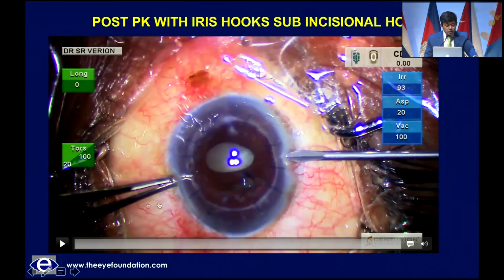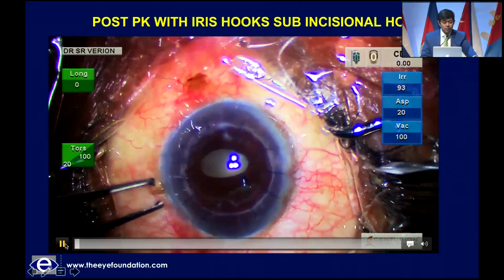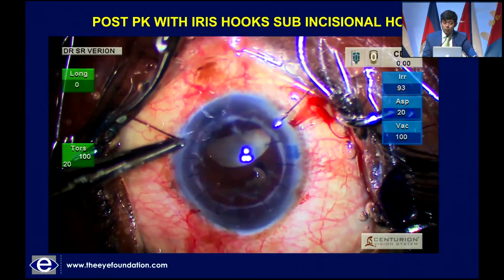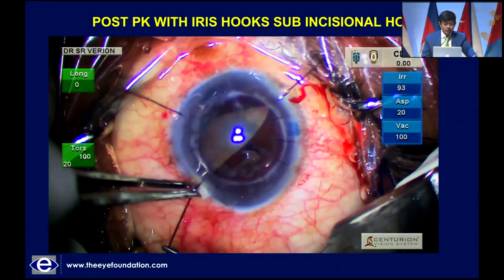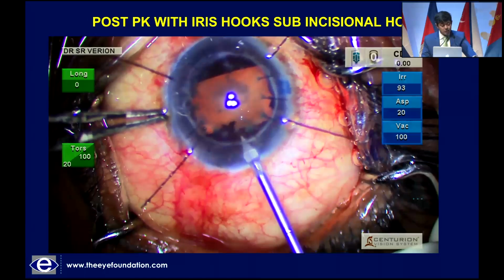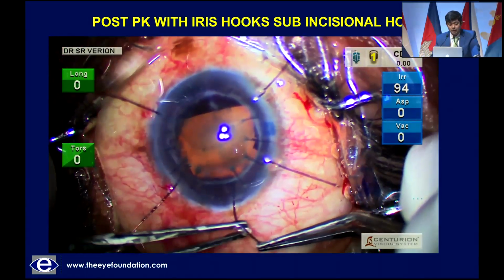Moving on to a situation now, it's not just visibility that grafts will give you a challenge in. You may have issues where the cataract is a little denser, the pupil doesn't dilate very well. You have some iatrogenic damage which might have been caused during the initial therapeutic or the optical penetrating grafts.